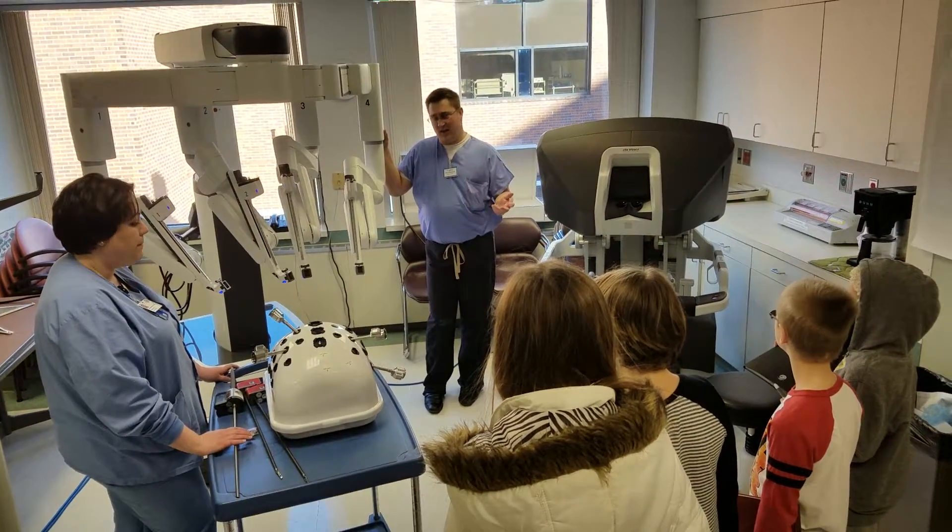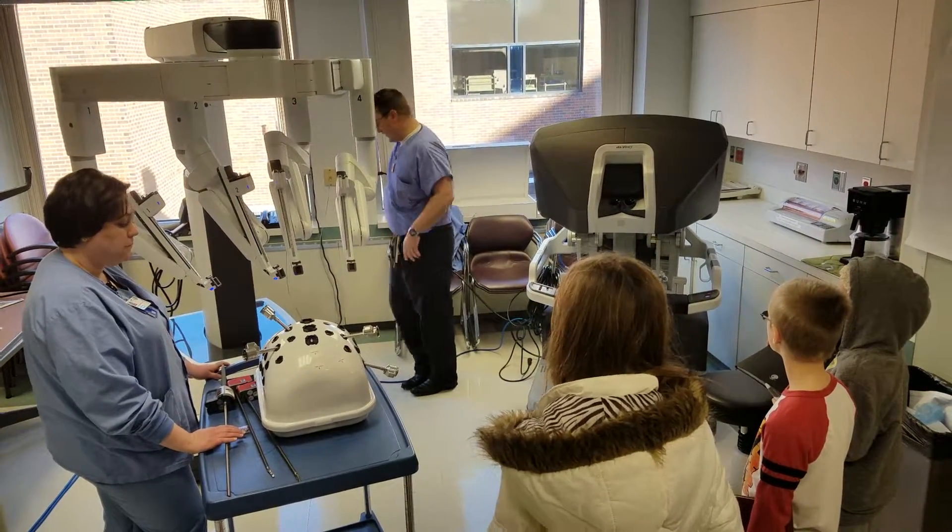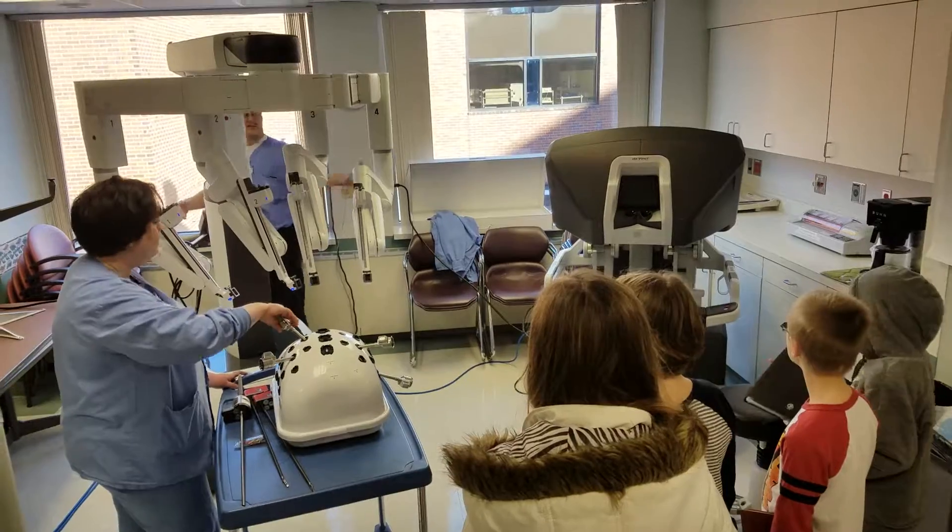And you'll kind of see with the robot some of the features of what the surgeon sees versus what we see here. So why don't you guys come around here? I want to show you something.